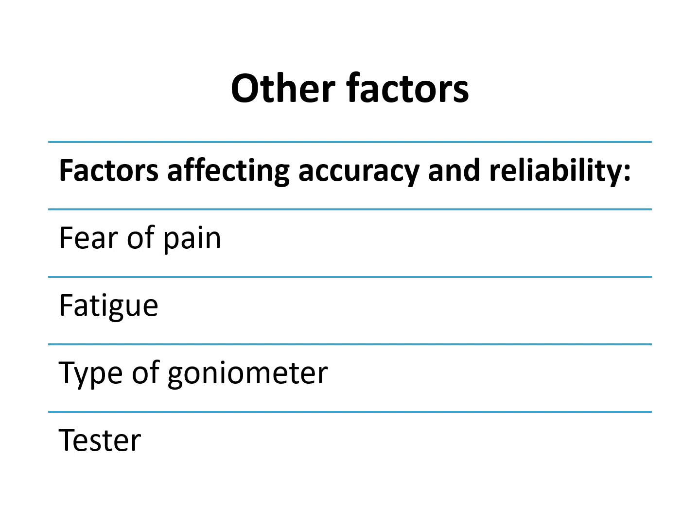Second factor can be fatigue. If you are trying the same range of motion on the patient a lot of times again and again just to check that you are right, or maybe you are practicing on the patient, probably the patient can get tired. If he gets tired, obviously the range of motion won't be accurate anymore because the muscles are tired.